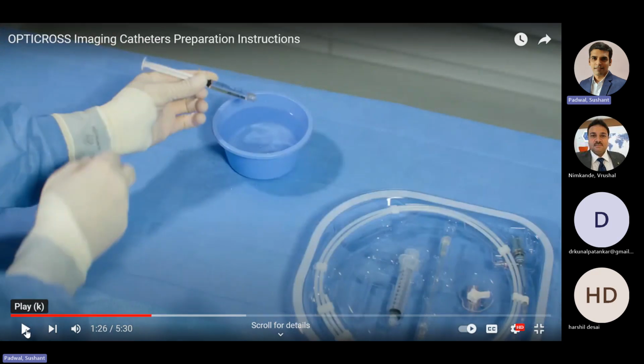In this step, you can appreciate one more thing. When the operator is trying to fill the saline in the syringe, he pushes it once or twice so that any vacuum or air trapped inside the syringe can be released, and the syringe which is filled up is completely air free, so that we don't have any air going inside the catheter.